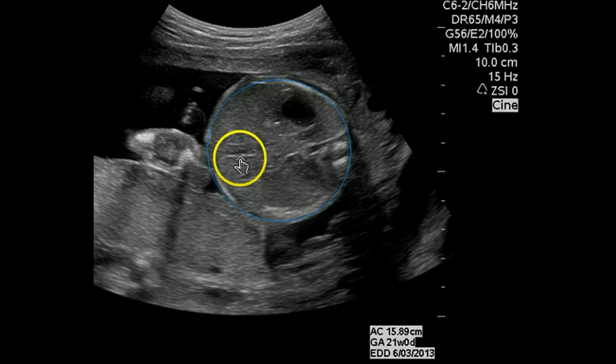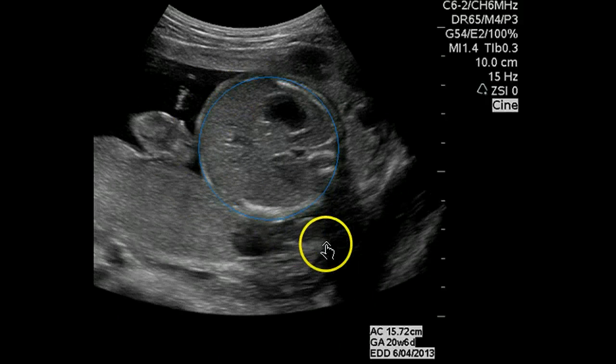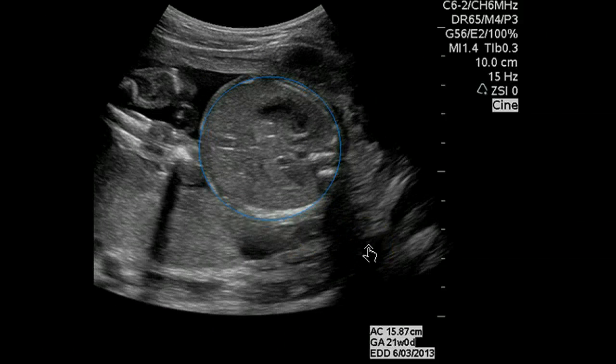We're seeing a little bit of the umbilical vein coming into the left portal vein, but we're not seeing the nice little curve there, which means we might be a little bit oblique, but we'll take that. And we like it to be tight to the skin. That's the best we could do. It's not going to make a huge difference. We're going to pass that, and we'll pass this too. And we'll pass that too.